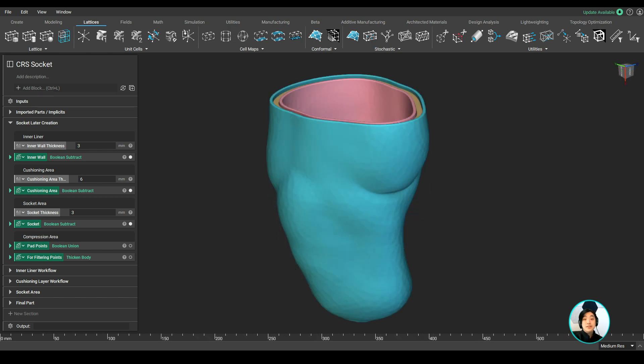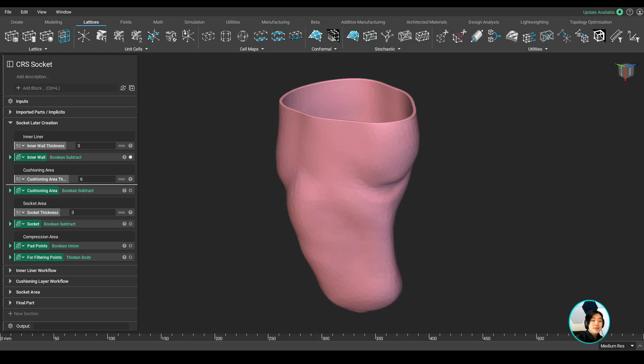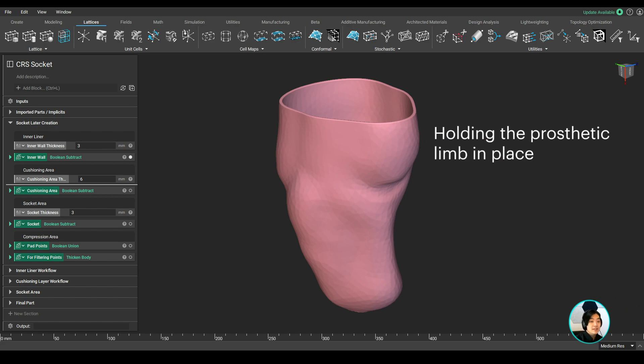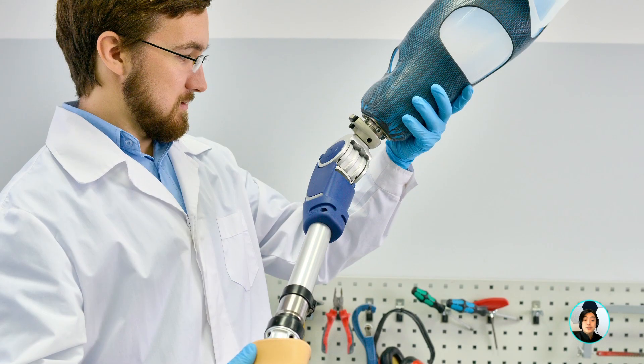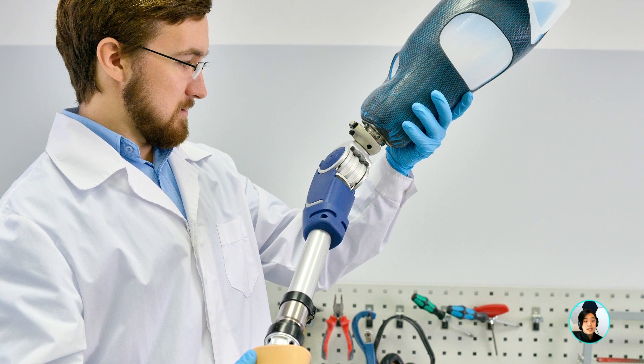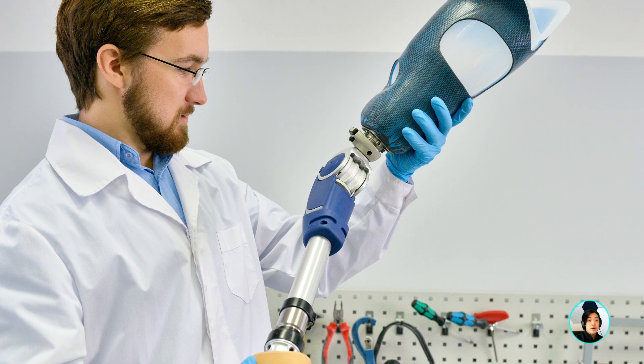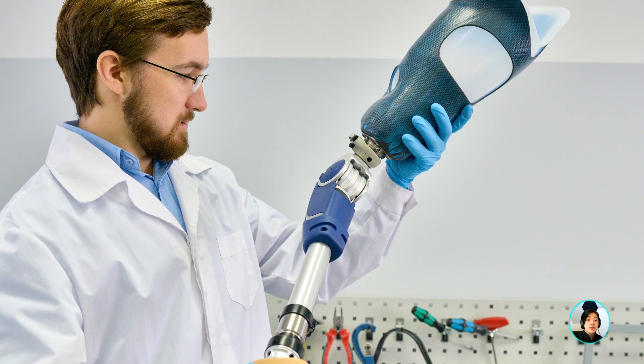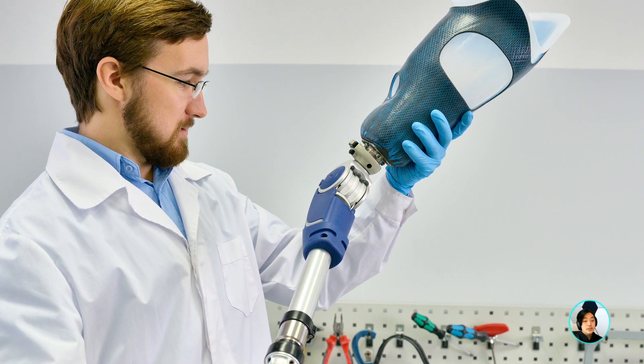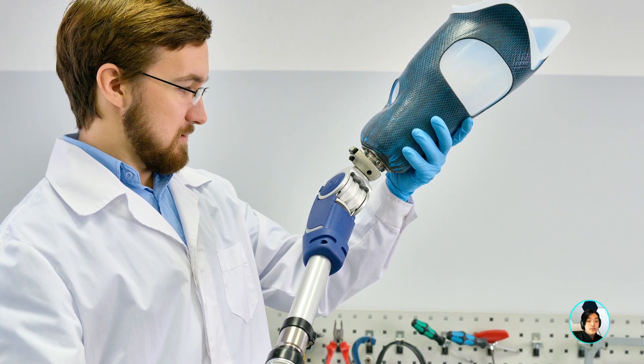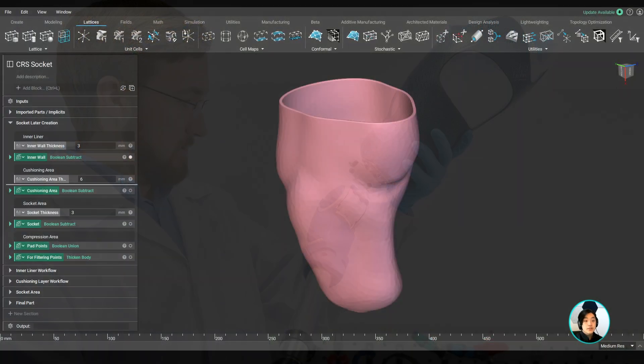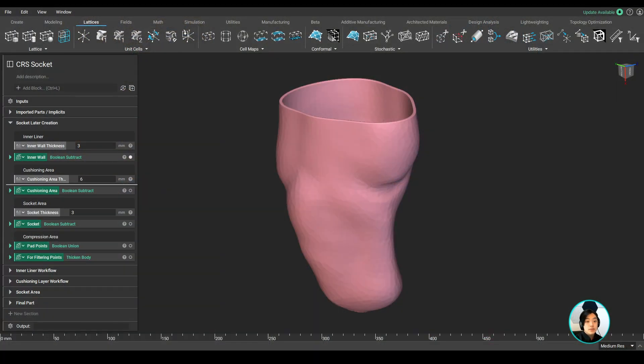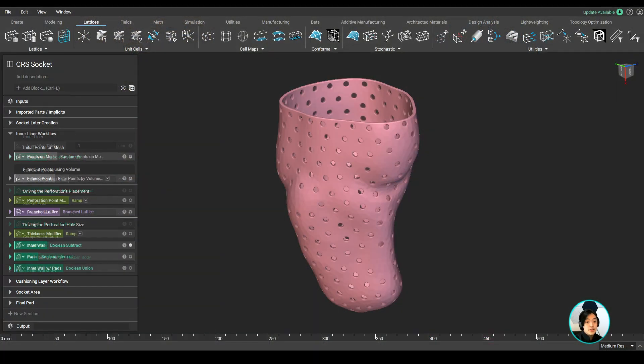Let's take a look at the first layer, the inner liner. It already fulfills the two main functions: holding the prosthetic limb in place and cushioning the residual limb. While doing research on prosthetic limbs, I read an article about where sweat can get trapped, which can lead to the growth of pathogens and bacteria. A good solution is to generate perforations to give the limb room to breathe.